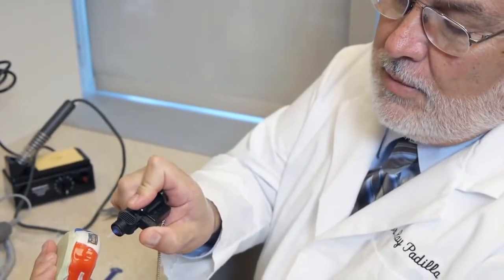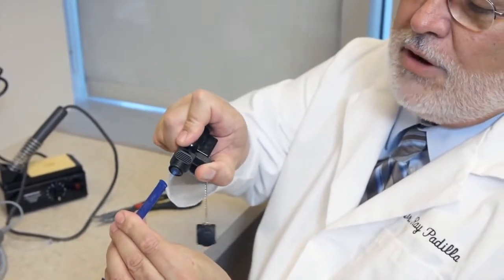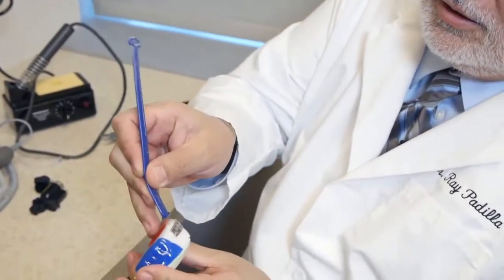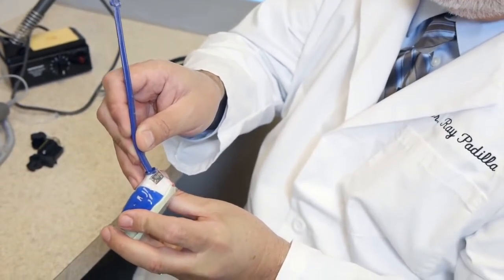Now, if your sport requires a strap, they can be placed on these. The strap is not necessary, but some sports require them. So you're going to heat the tip of your mouth guard, then heat the tip of your strap, then you're going to lute it together at a 45-degree angle and just let that cool.